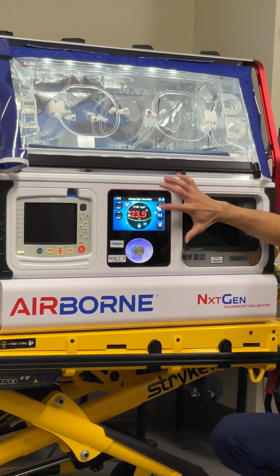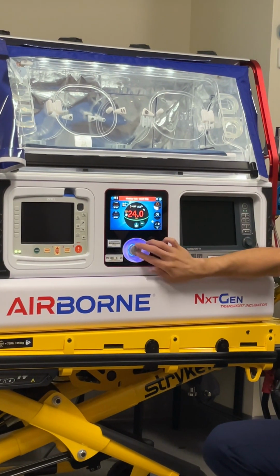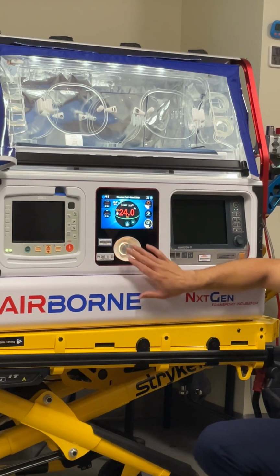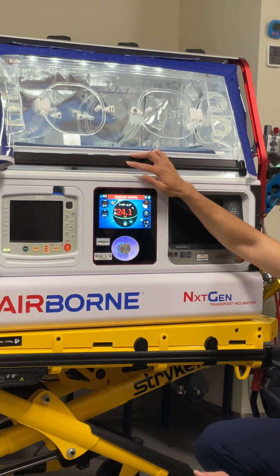Got to press the X to get out of here. And then this is to adjust the screen brightness. So if I wanted to, I could change the brightness of this. I don't know if that's really going to have a huge impact on battery life, but that's what it's for.